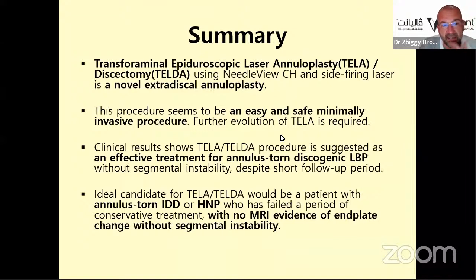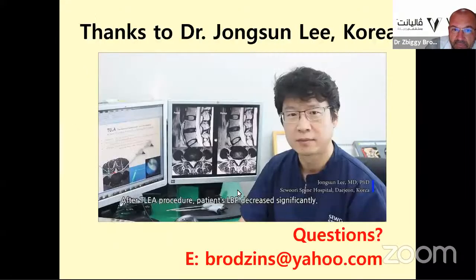So in summary, this transforaminal epiduroscopy laser annuloplasty is a new extradiscal annuloplasty. We are not performing an intradiscal one like for IDET, for instance. It's a very minimally invasive, safe procedure in local anesthesia and very superficial IV sedation. If you have additionally the MRI evidence of the end plate change, you can also perform additionally this basivertebral nerve denervation, so you can combine discogenic and vertebrogenic back pain.